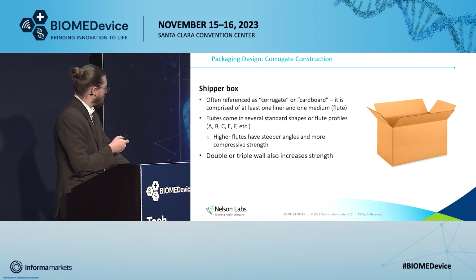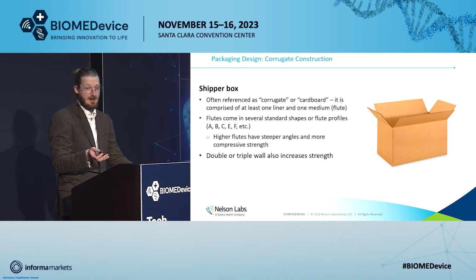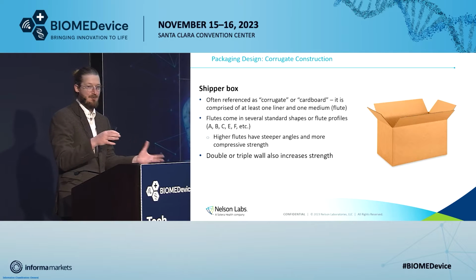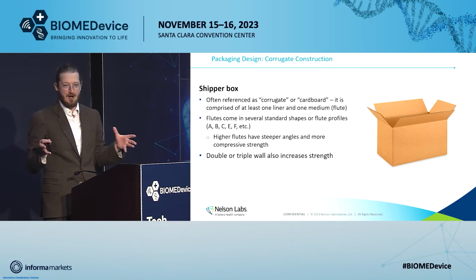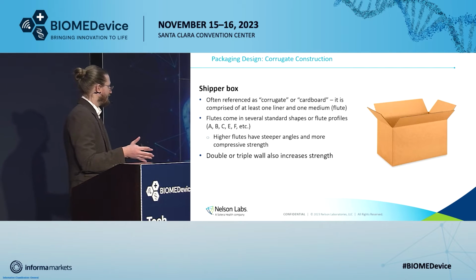The last thing to talk about is just the shipper box. It's not acting as a sterile barrier, right? But how full you load your shipper box can affect how much your cartons are shuffling around in there, right? Kind of those same principles of restricting movement and keeping it exactly where it needs to be throughout all of transit will make sure that it arrives without much damage.